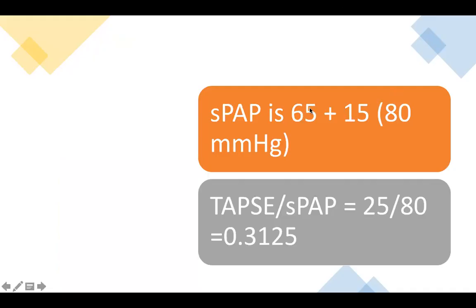There is another important sign. When we divide the systolic pulmonary artery pressure — obtained from the tricuspid regurgitant gradient of 65 plus 15 for the dilated incompressible IVC — we get a systolic pulmonary artery pressure of 80 mmHg. Dividing the TAPSE by the systolic pulmonary artery pressure gives an idea of RV-pulmonary artery coupling, which is 0.3125.